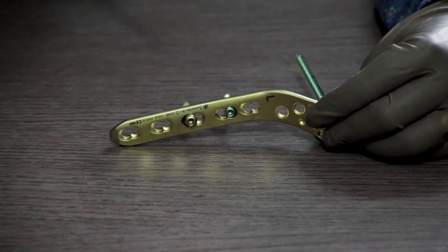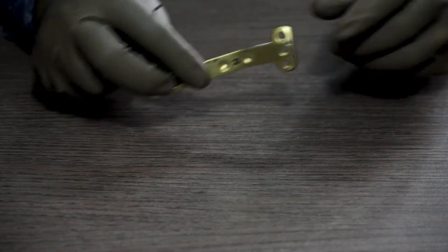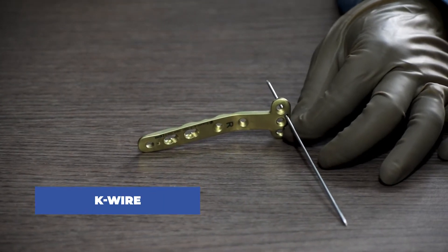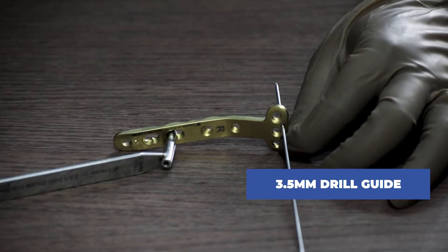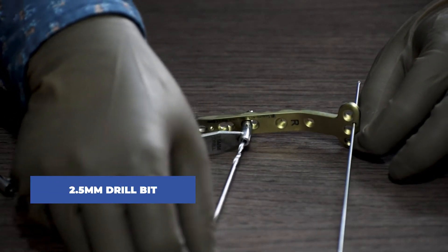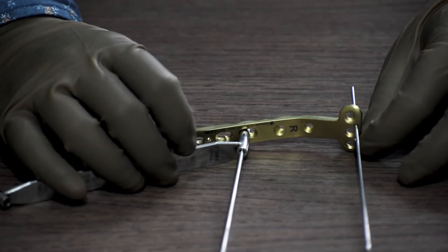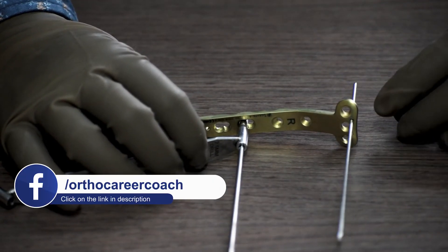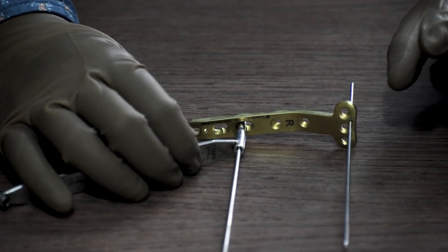The process of fixing locking plates for proximal tibia fracture is almost the same for each plate. We have shown the 4.5mm system; now we will show the procedure for a 3.5mm system. We are taking a proximal tibia locking plate medial 3.5 system. To start, we hold the plate at the fracture site with a K-wire, then use a 3.5mm drill guide and a 2.5mm drill bit to drill through the non-locking hole. Depending on the manufacturer, this drill bit can be 2.5mm or 2.7mm.